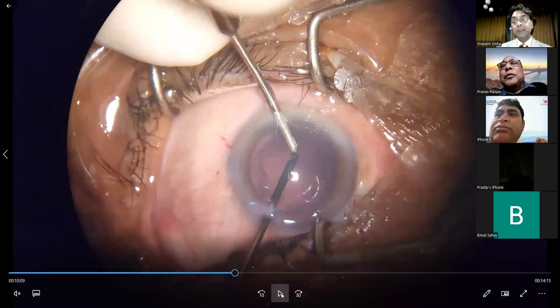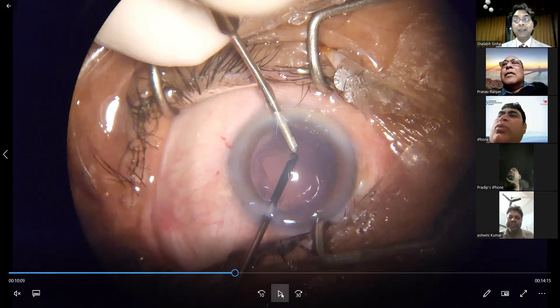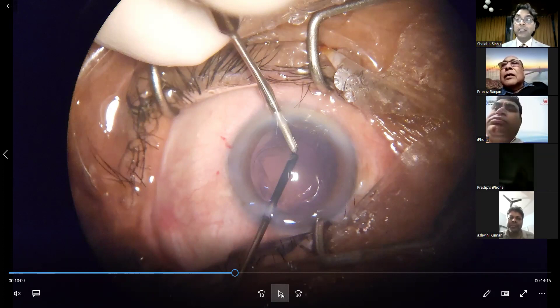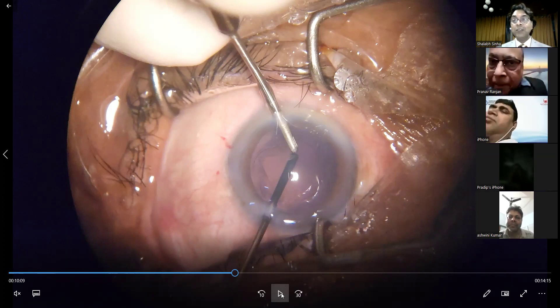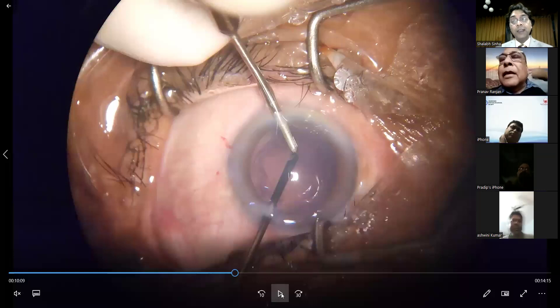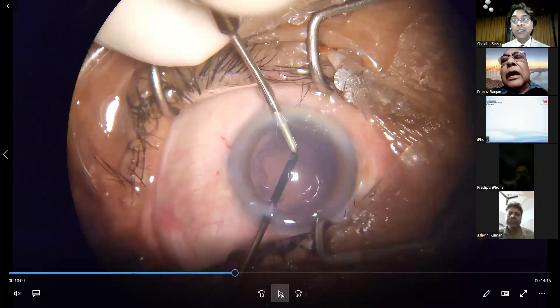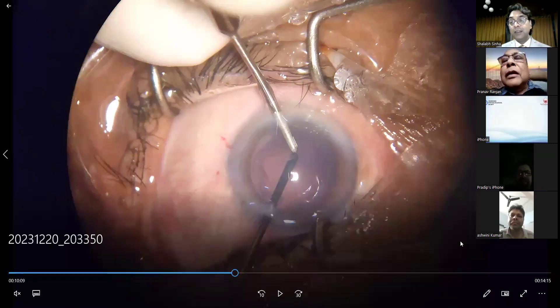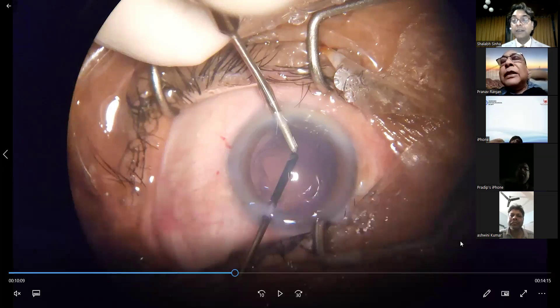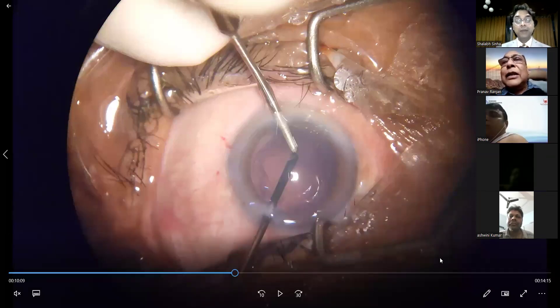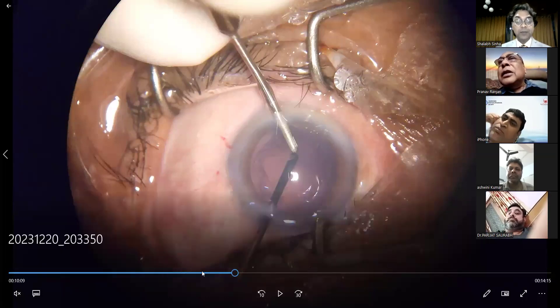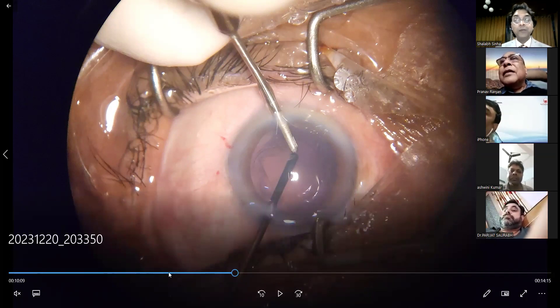Question: Why did you observe the PCR so late? The reason was that when I removed the phaco handpiece after taking out the last piece, the PCR wasn't visible at that point. It was only when I introduced the irrigation-aspiration that it became apparent. One way to ensure whether the posterior capsule is intact is to tilt the eye left or right, up and down, to get a good red reflex — even small tears can probably be identified this way.